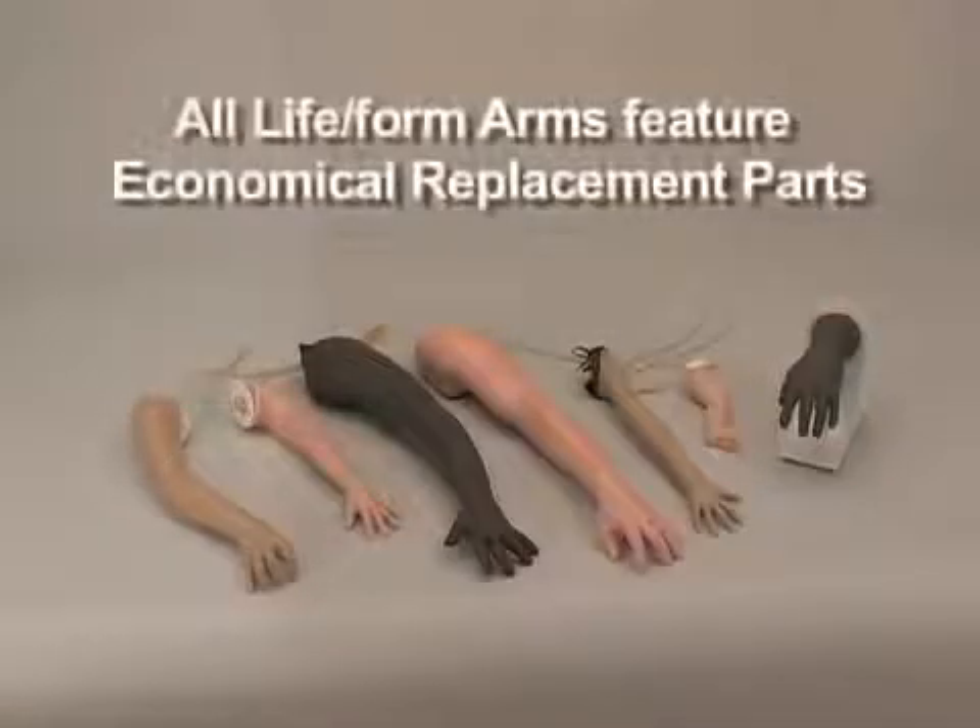All of our NASCO venipuncture and injection training arms feature economical replacement parts, extending the life of the product.